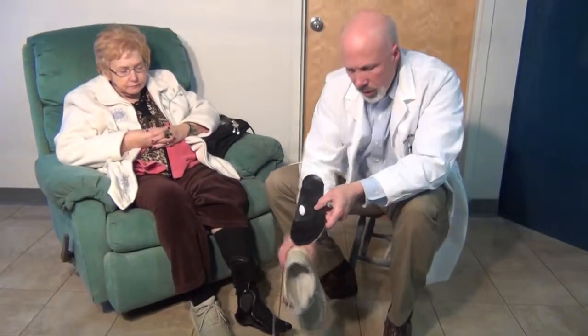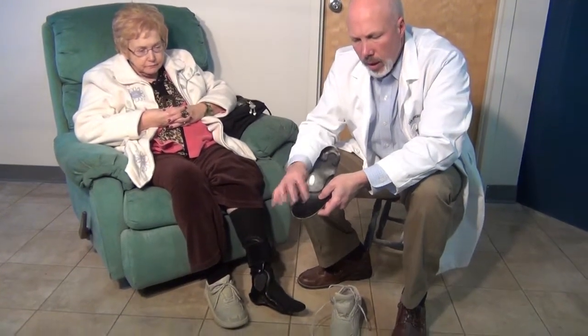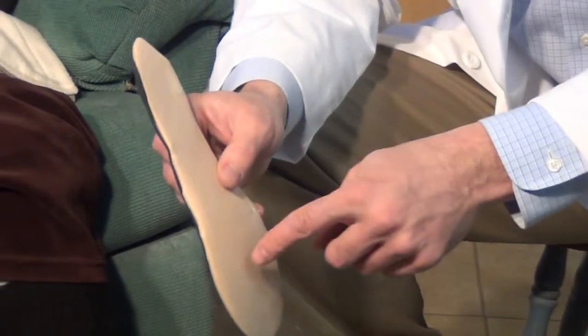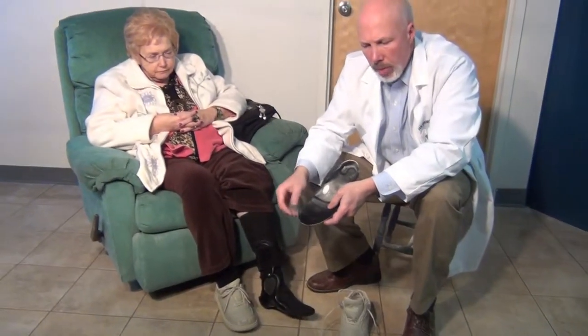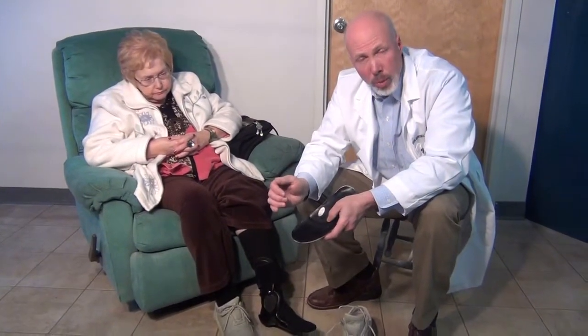So we're going to take care of that problem today. The shoe didn't have an insert, so we've created an insert out of a very low coefficient of friction leather and with Plastazote. After a while the pressure packed down the Plastazote and we can see exactly the area of high pressure that's causing the problem.